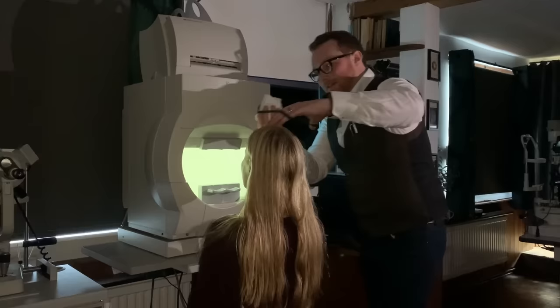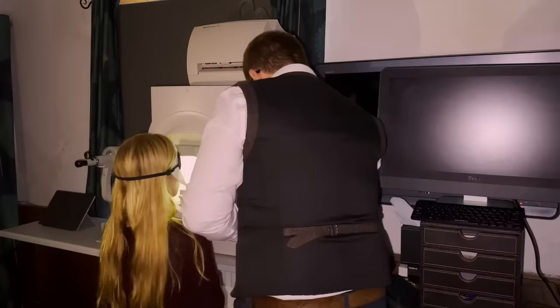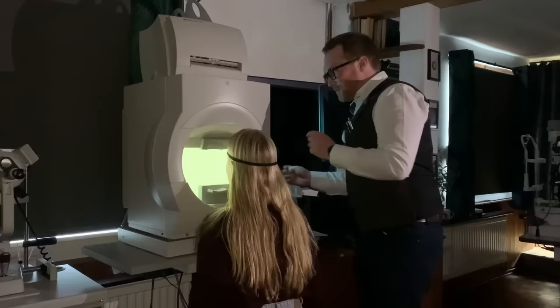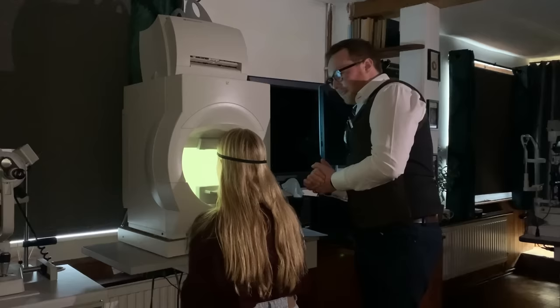Thank you. And I'll give you your clicker back. Thank you. And you guessed it, you're on the other side of the chin rest this time. Forehead up against that bar at the top. Now I'm just going to move the chin rest to the side a little bit. Just bring you across and bring you down a fraction. Is that still comfortable there for you? Yeah? So just blink as often as you need to.